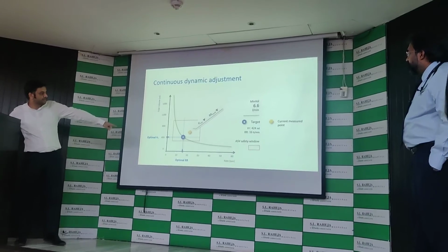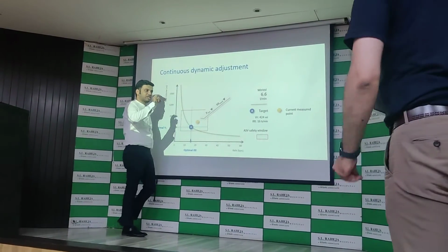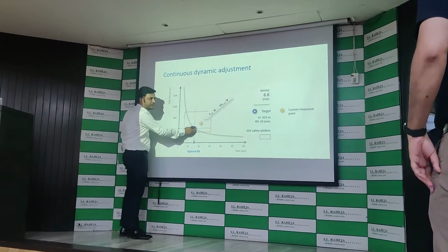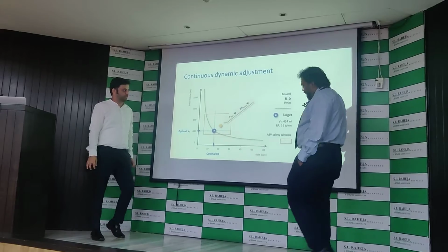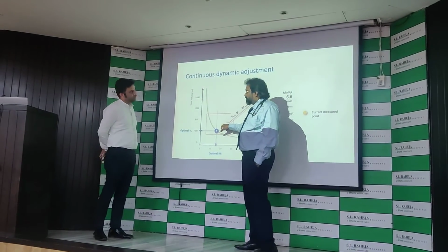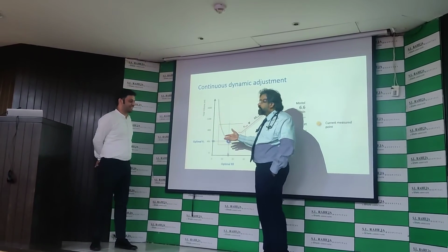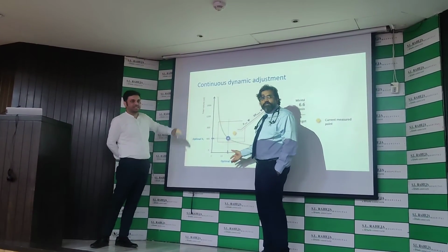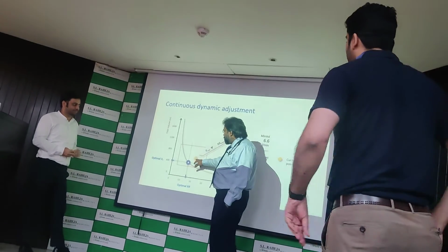This plus sign, and there's a target. Whenever you change the setting, the machine will try to come and meet this target point. I am not looking at this point; the machine is looking at this point. If I have to look at this point, then it defeats the purpose of adaptive ventilation. We don't try to do matching of this. The change will be based on the machine.